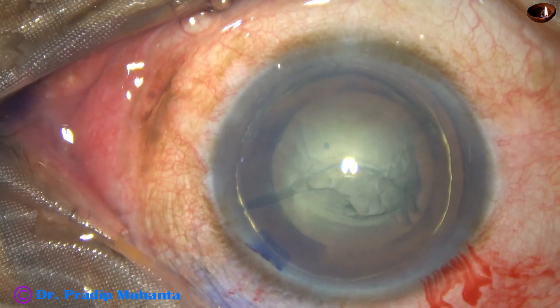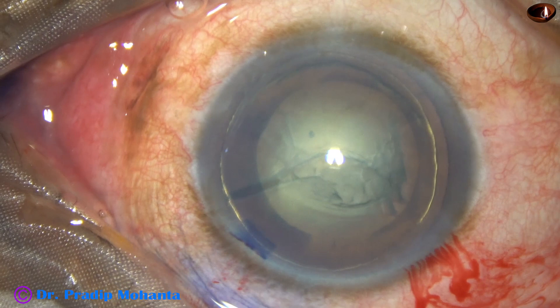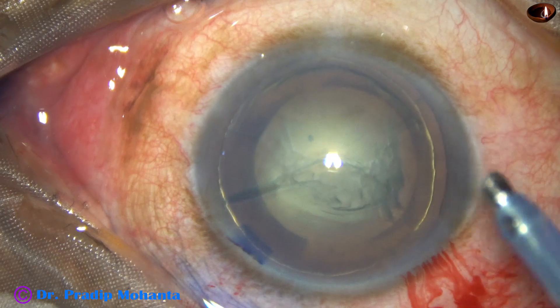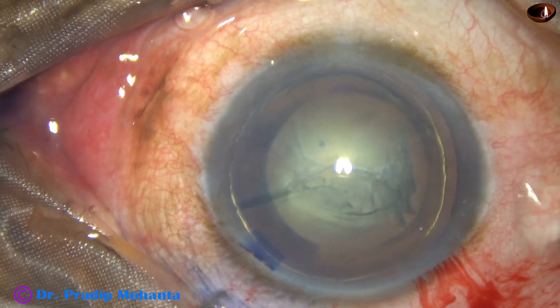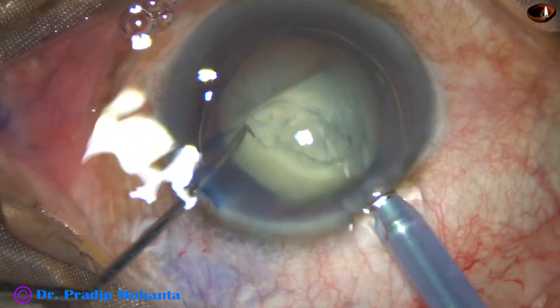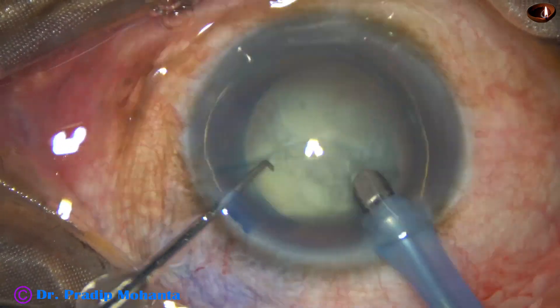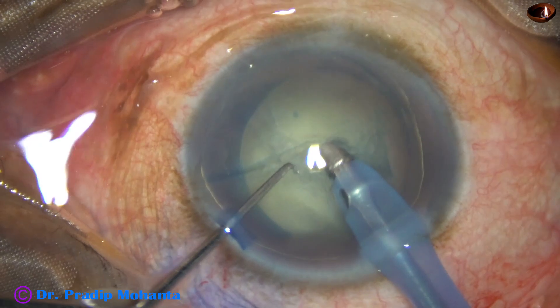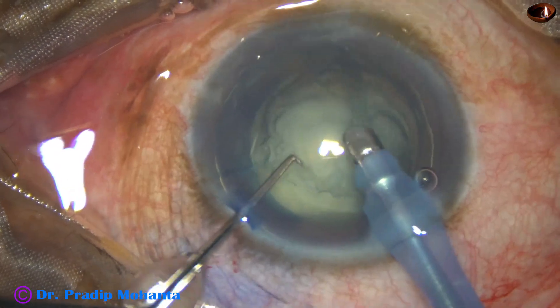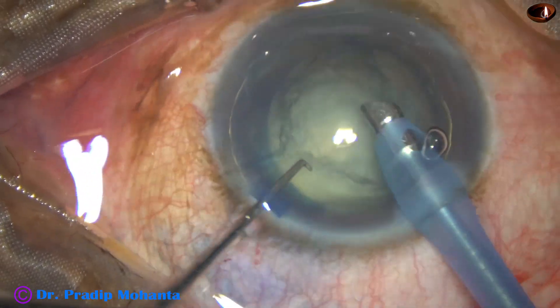The phaco handpiece is used to manage the nucleus. The idea is to remove the nucleus, and if posterior capsule rupture occurs, it should occur at the last moment. No nuclear piece should drop into the vitreous cavity.